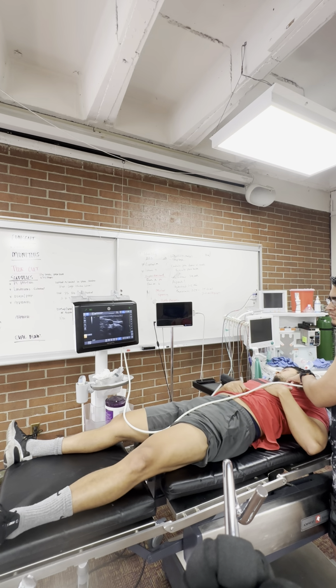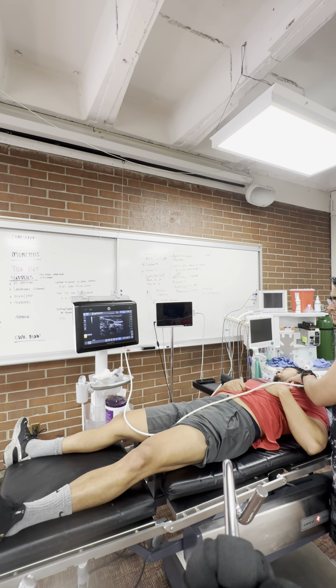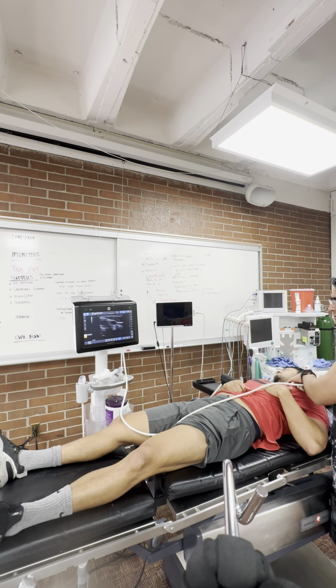And then once we've gotten blood return and we've been able to advance our wire, we want to make sure that our wire is still in the vessel. And so what you want to do is you just want to rotate your probe. And now we have visualization of your carotid beating there inferiorly. The IJ is in the middle of the screen there, which we can compress. See that? And then the sternocleidomastoid is just going to be superior to that. Again, carotid, IJ, and sternocleidomastoid superior to that, and it's compressible.